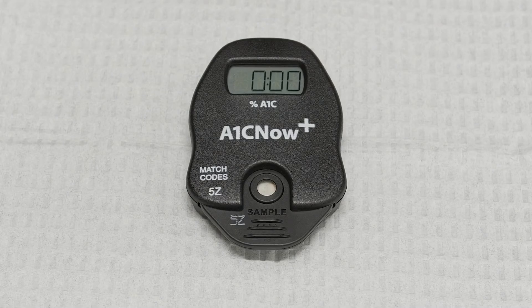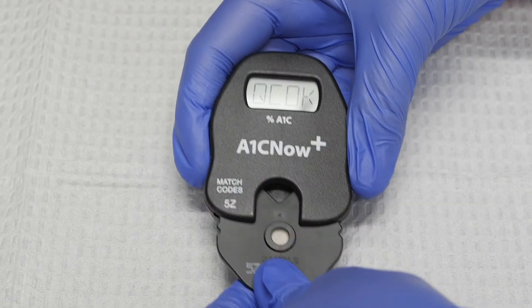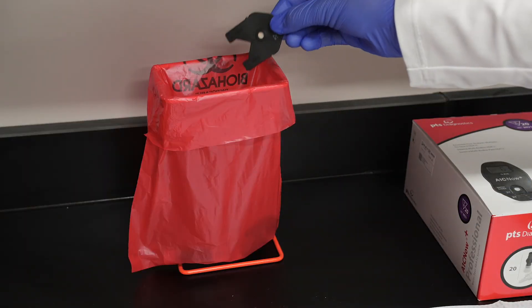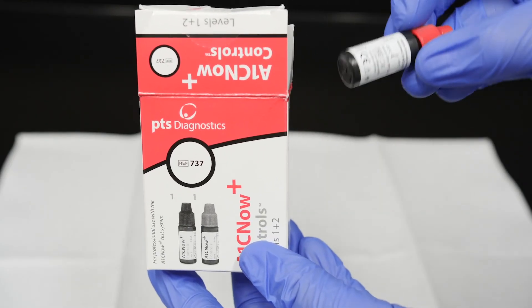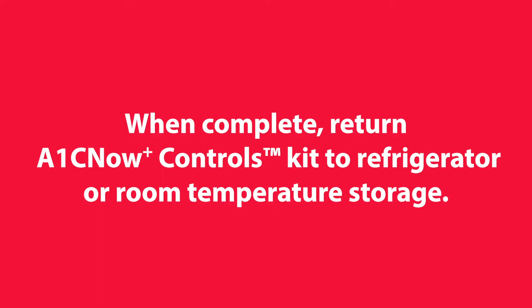Once the results appear, check the ranges in the A1C Now Plus control's instructions for use to see if your results are within the specified range. Record your results and remove the test cartridge from the analyzer. Discard the test cartridge in a biohazard container. Using new shaker and cartridge pouches, repeat the procedure using the Level 2 vial of control solution. When complete, return the A1C Now Plus controls kit to the refrigerator or room temperature storage.